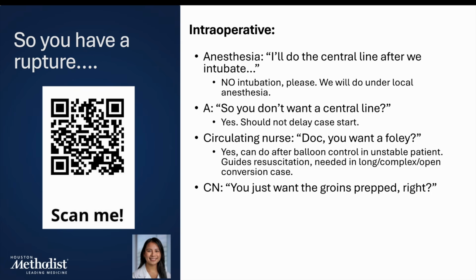Alright, so you just want the groins prepped, right? We're going to do an EVAR. So no, the answer is nipple to knees for anything aortic, and this is of course in case you have to convert to anything open. In this situation, it's also useful to have the left arm out. As you know, this is a kind of a complex case anatomy-wise, and it may be useful to go from above. So you should at least keep that option open for yourself.